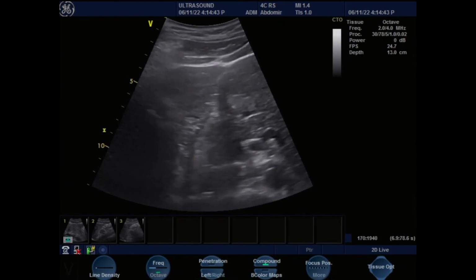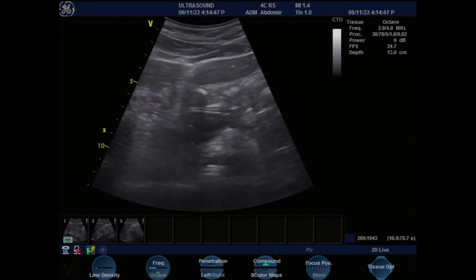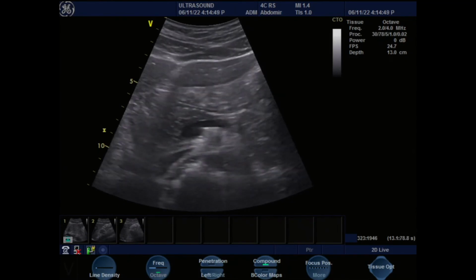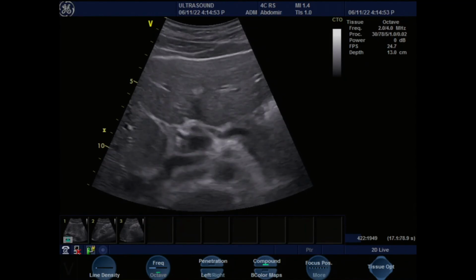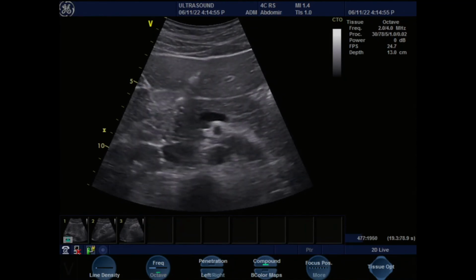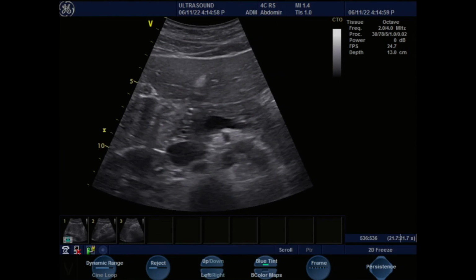Nope, we're going over now. So push your belly up. Beautiful. Hold it right there. Press and hold and release. That's a beautiful pancreas.